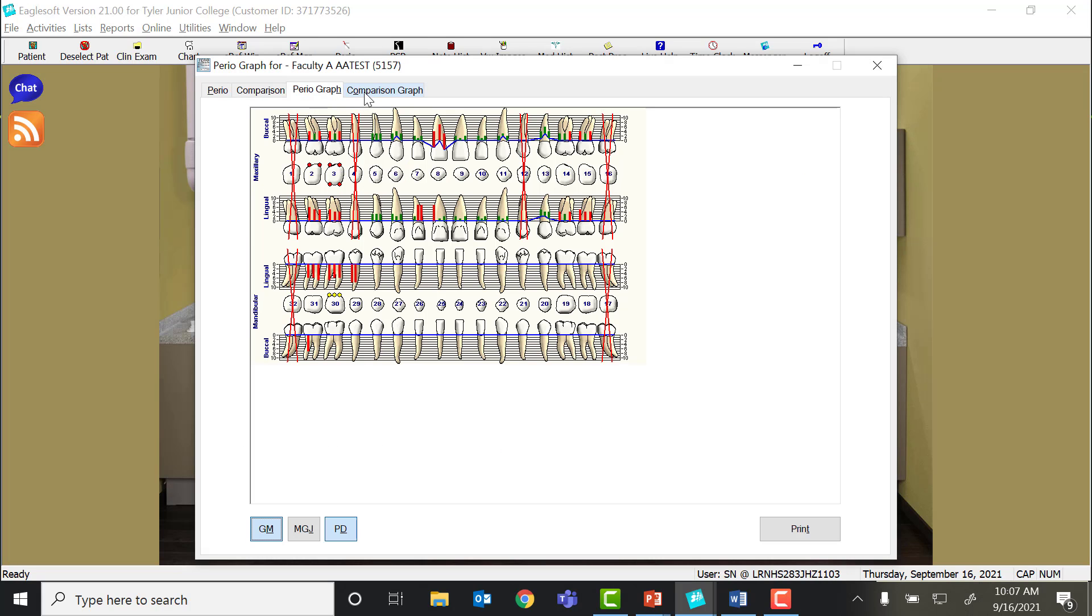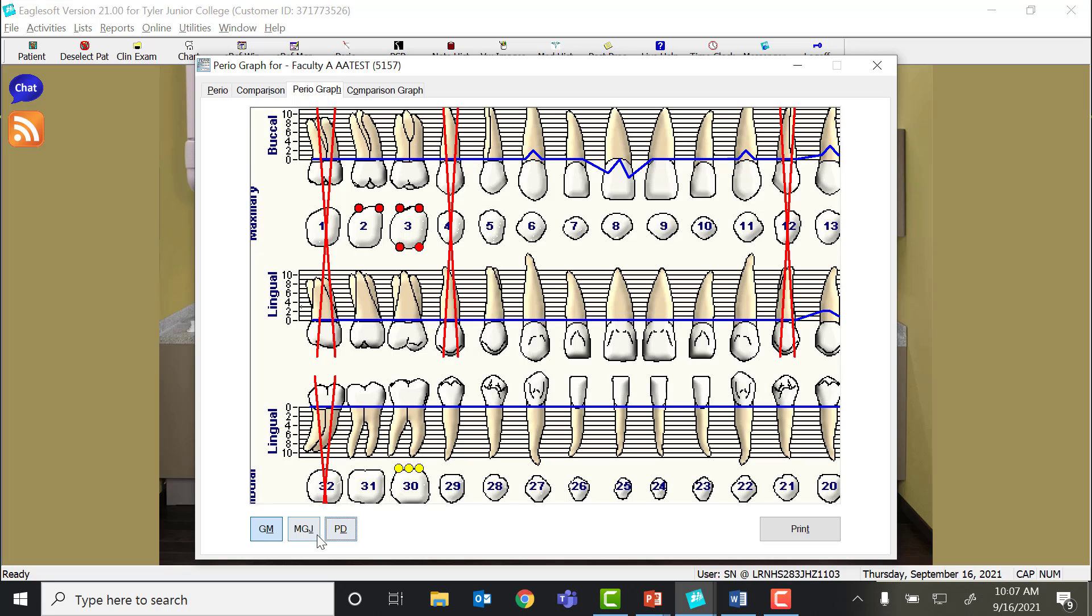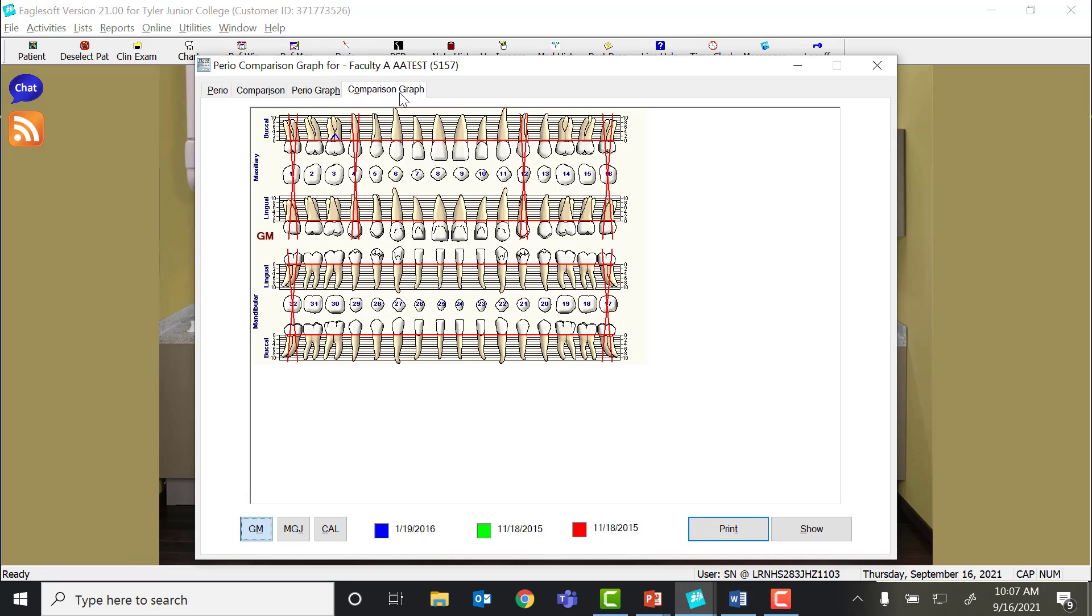You can also do a periograph which shows the progress in line. This is a great visual for patients, honestly, to show the red and the green and places they need to work on. And you can select what you want it to actually show. And then there's a comparison graph where you can select the dates that you want it to show.